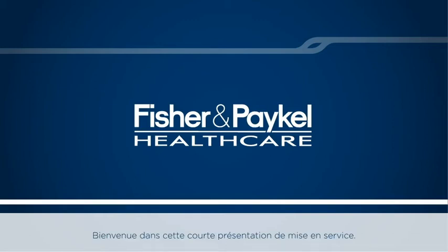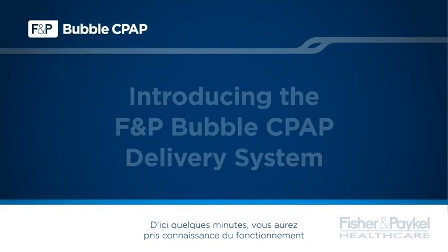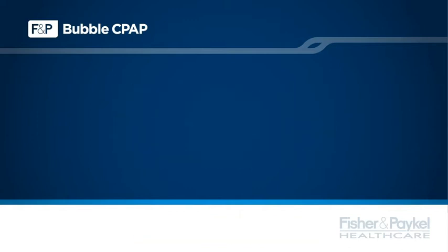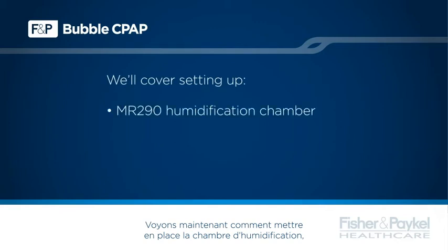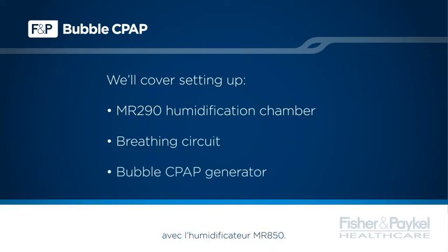Welcome to this short in-service presentation. In the next few minutes, we will become familiar with the Bubble CPAP delivery system. Always refer to the user instructions supplied with the product for a full list of instructions, warnings, contraindications and explanations. Let's now look at how to set up the humidification chamber, breathing circuit and Bubble CPAP generator with the MR850 humidifier.